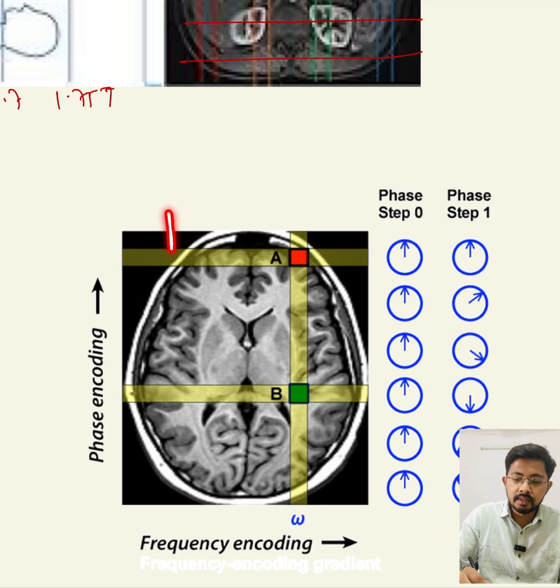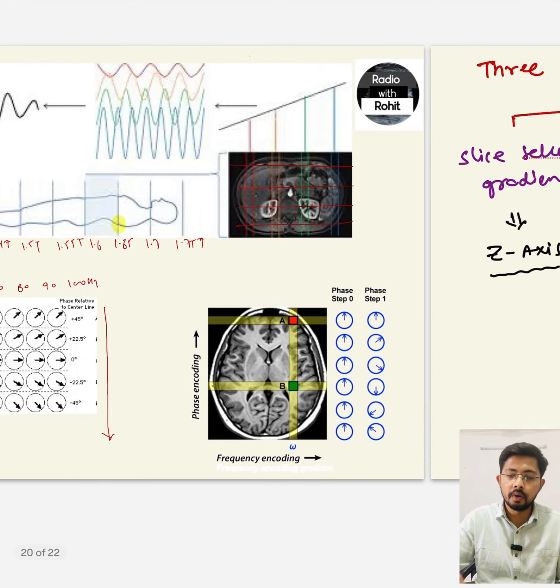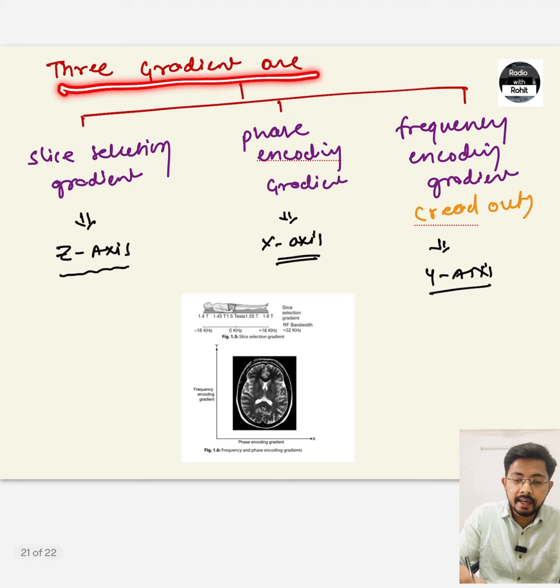Imagine this is at 60, 70, 80 hertz and this is at 1 o'clock, 2 o'clock, 3, 4, 5, 6. Then we find the 1 o'clock position at this particular frequency, and we come to our answer of the particular localization.